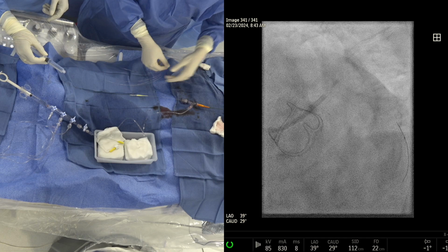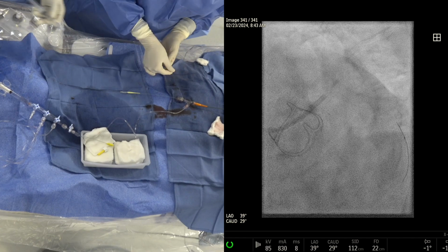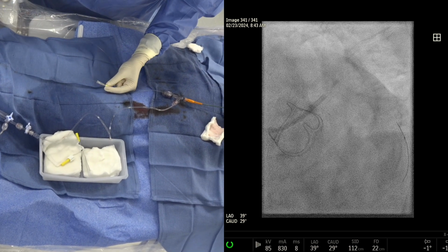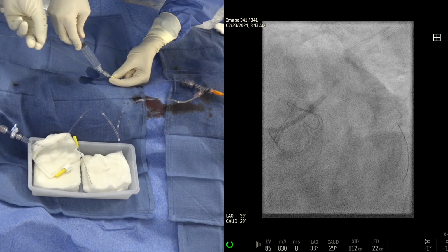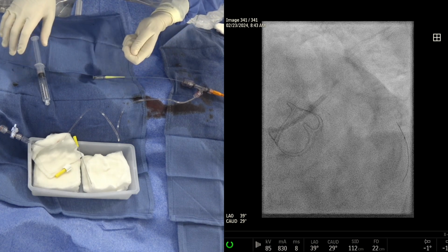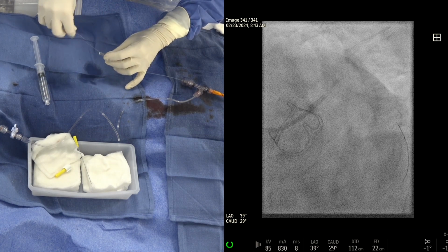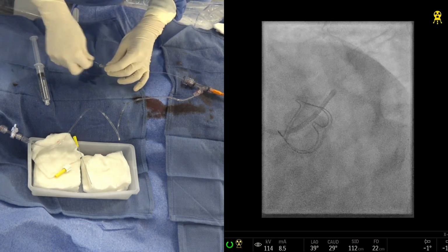Sure. Just for academic purposes, knowing the decision has been made to do atherectomy, we know that for the calcific nodule all devices do work: atherectomy, rotational, orbital, which we have published, and IVL does work also in this situation. So now the question is which one is a little more effective. There are some papers coming that maybe RA is slightly more effective than IVL in the calcific nodule. Our data, which will be presented soon, also shows the issue remains the vessel size. When we use IVL, a bigger vessel is needed compared to rotational atherectomy.